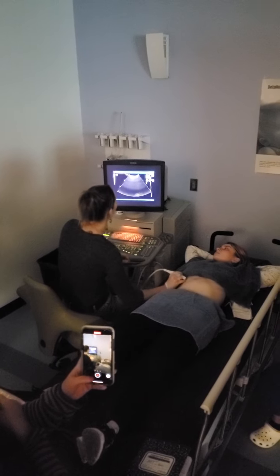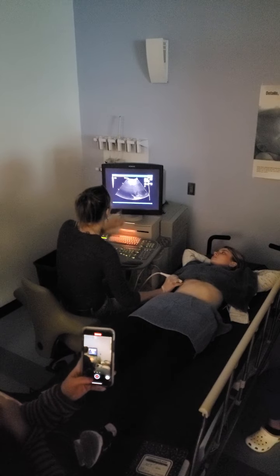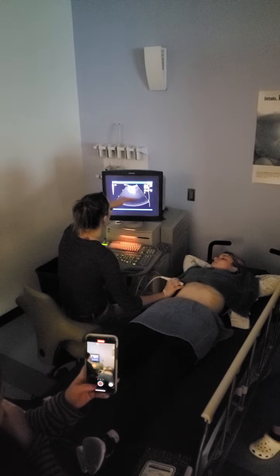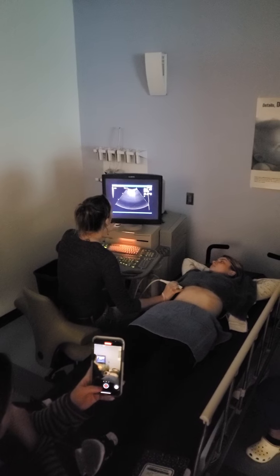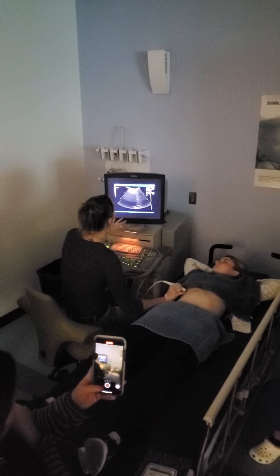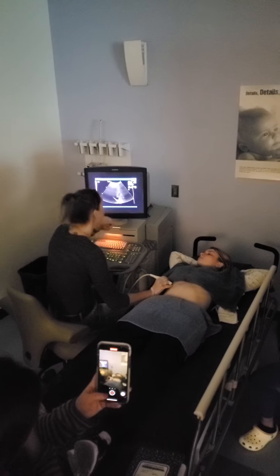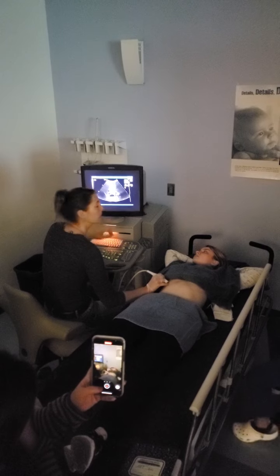So this is our intercostal space. Go ahead and take a big breath in and hold it. This is lung. See how it looks like a little reverberation line? That's lung. Go ahead and breathe out. We can actually watch it slide by. Sometimes big breaths in may not help if we're in this window trying to get these.